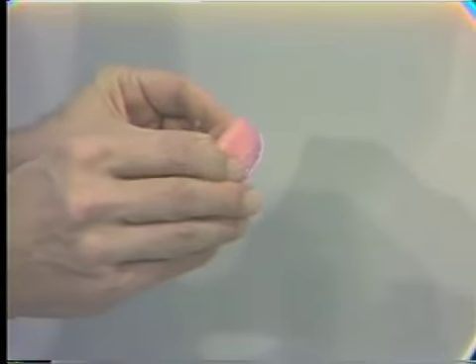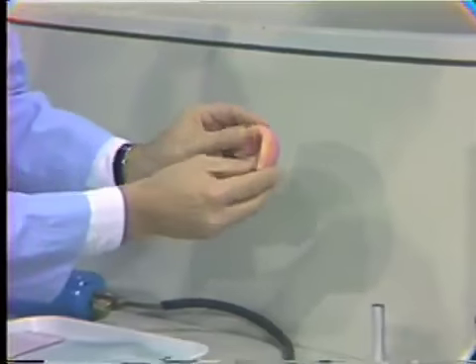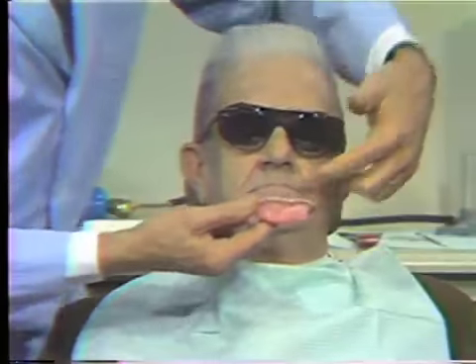Now we can go back to the patient. And if you'll open for me, Mr. Monahan. And we'll place the maxillary rim in and just let him relax and squeeze slowly, just a bit. Now, at that dimension of occlusion, you can see it's obvious he is open. His jaws are too far apart. Now just squeeze a little harder. Just a little harder into the soft wax. That's good, right there. Now we'll see what the measurement is.